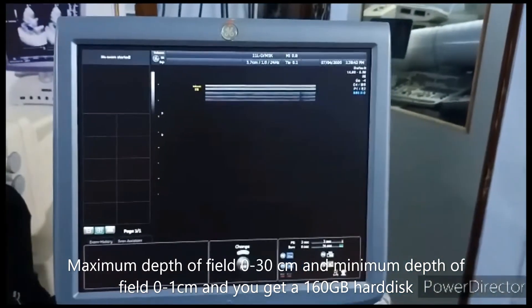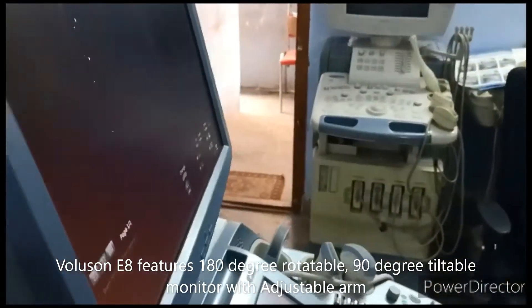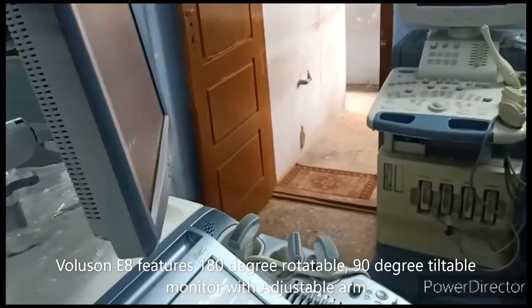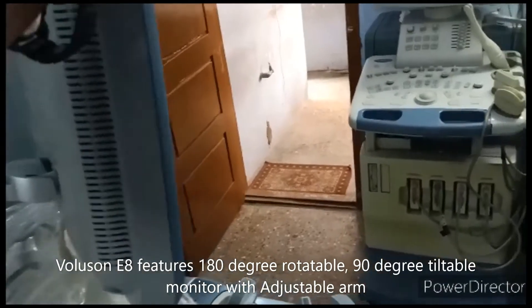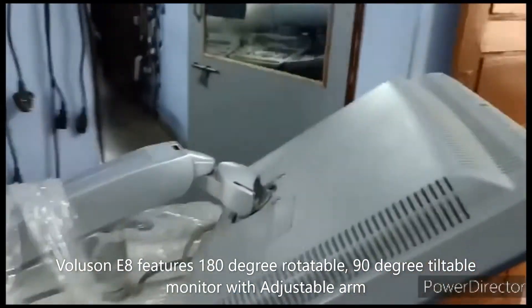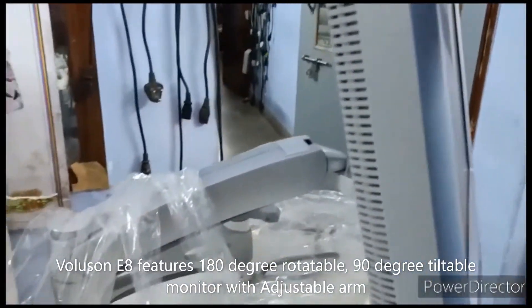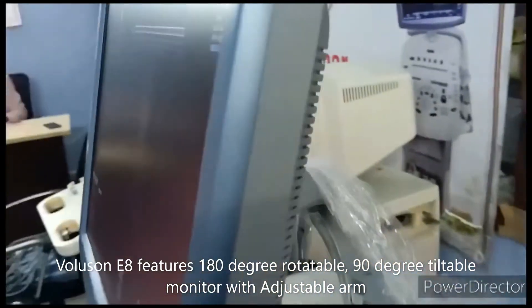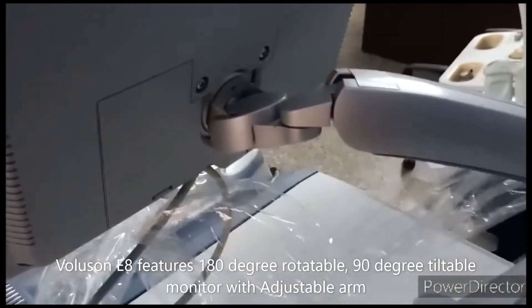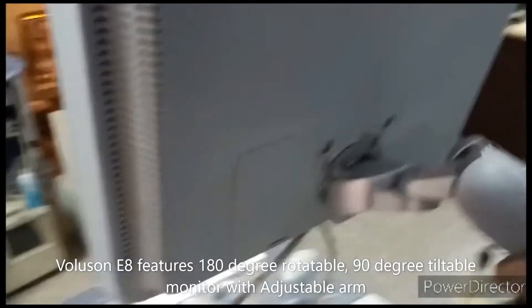You can rotate the monitor 180 degrees, and you can also tilt it up to 90 degrees. This is useful when you need to ship or clean the machine. After completing the exam, you can shut down the machine and wrap it with clean cloths — you can hold it in that position.